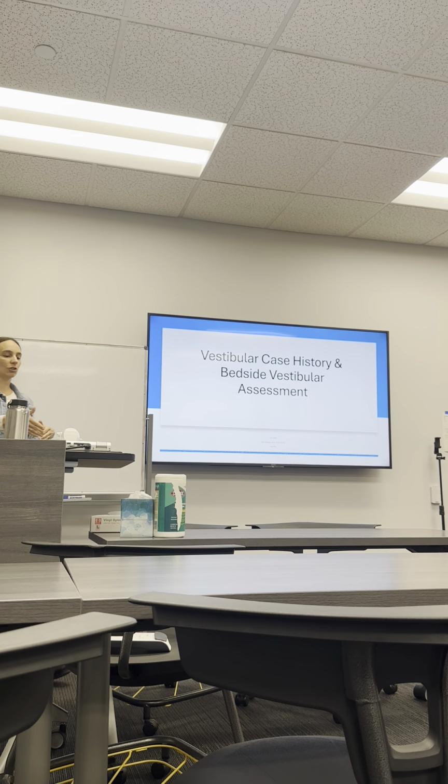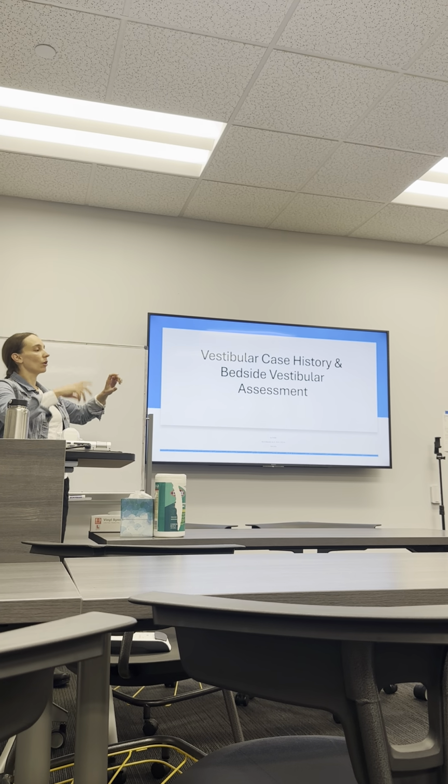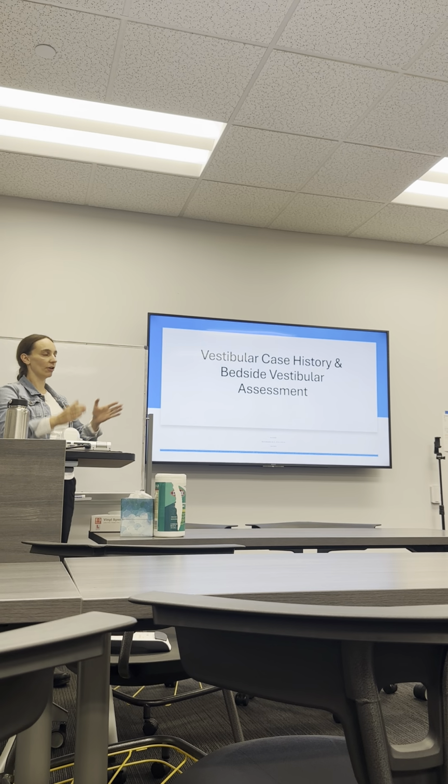If you are a very skilled clinician and you have really good front desk triage, you can listen to a patient's story, get the case history, and say, hey, I only need you to come in for a VHIT and VEMPs. That could be a 45-minute appointment. You could see 7 or 8 of those people in a day, and then allocate the more aggressive, longer tests for individuals that need to come back and do that type of work.